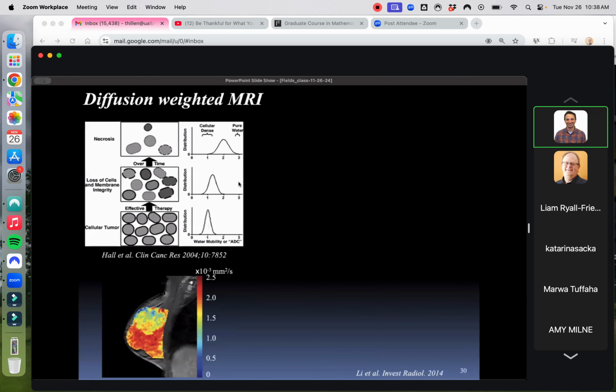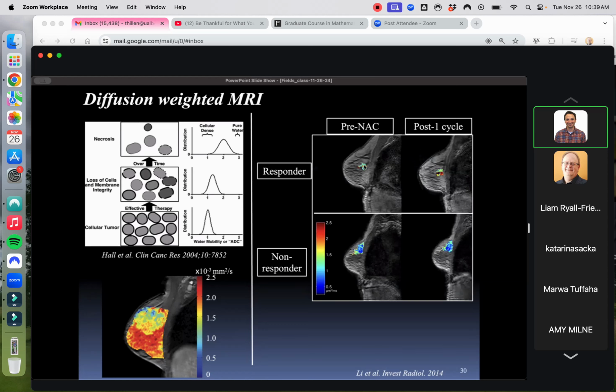The other one that we want to remind ourselves about is the diffusion weighted MRI. Each pixel has a bunch of cells in it, and water diffusion is restricted because it's going to hit these barriers, these cellular membranes. And so you might have a reduction in the apparent diffusion coefficient here. If you give a cytotoxic therapy that's effective, as you move from here to here in time, less cells over here, less water restriction, and so your ADC distribution will shift to these higher values, and that's what we saw over here in this responder. Some initial distribution of low ADCs, and now there's a lot more red guys over here, indicating the cell density has reduced, right, as opposed to a non-responder. And on their own, the area under the curve is 0.81 for these 2 things.